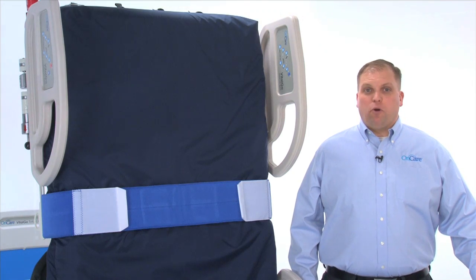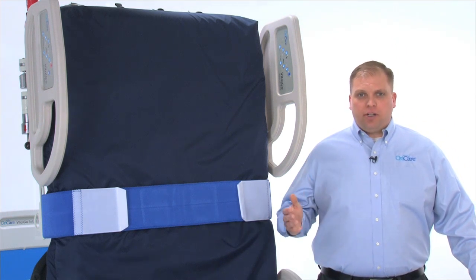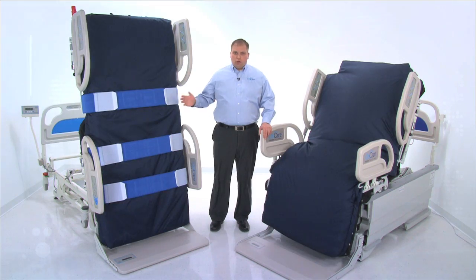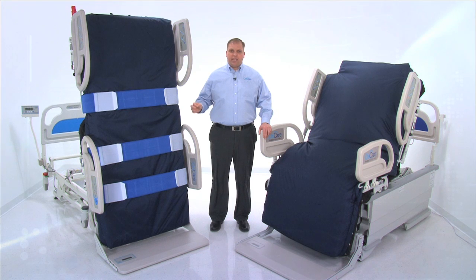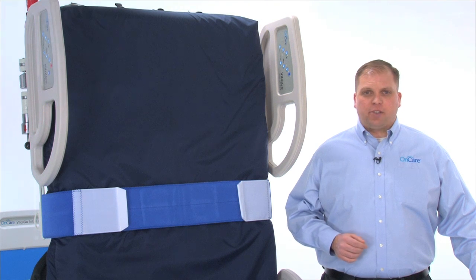The clinical benefits of mobility, weight-bearing, and tilting among critical patients are well established, but traditional methods are often impractical or unsafe. With the Total Lift Bed, patients can benefit from these therapies within the safe confines of their beds. Caregivers and patients are protected and therapy time is maximized.